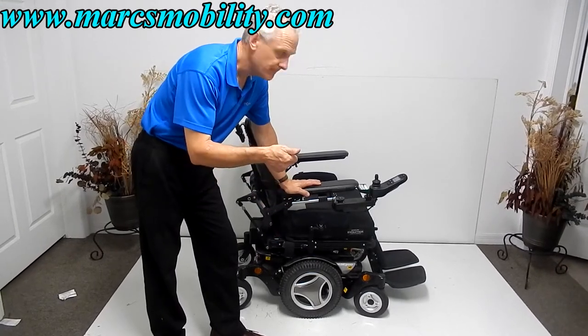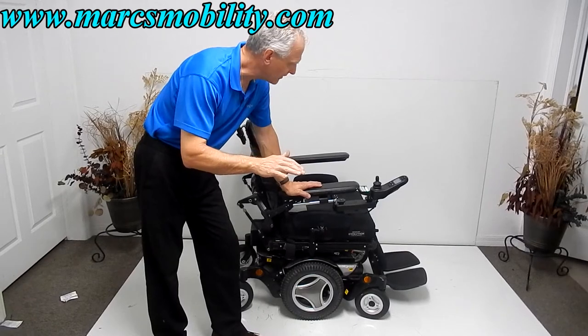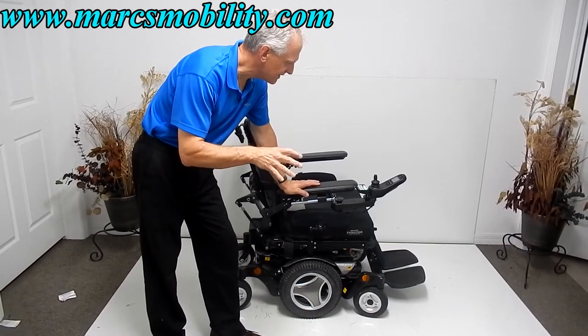It has electric tilt, electric recline, and electric legs. There is no seat lift on this one, but this chair has everything else but the seat lift.